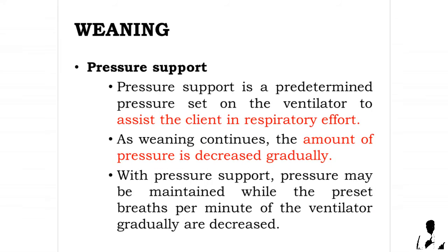Pressure support. Pressure support is a predetermined pressure set on the ventilator to assist the client in respiratory effort. As weaning continues, the amount of pressure is decreased gradually. With pressure support, pressure may be maintained while the preset breaths per minute of the ventilator gradually are decreased.